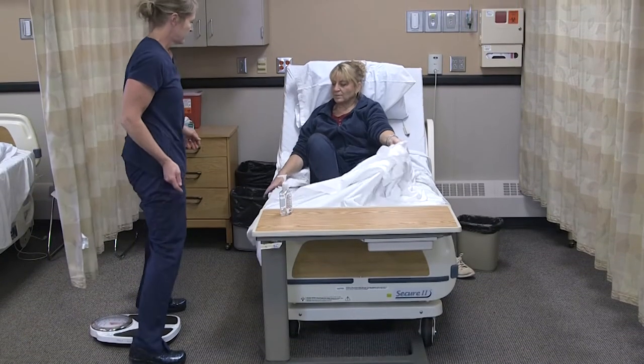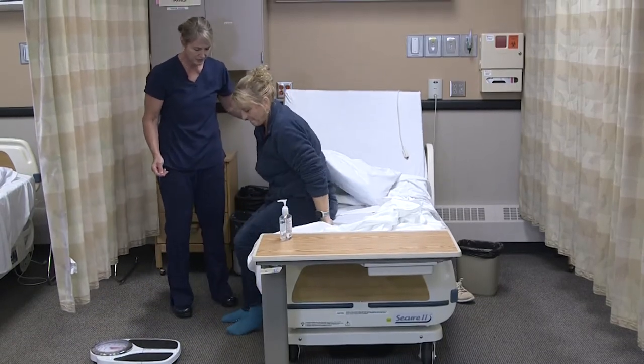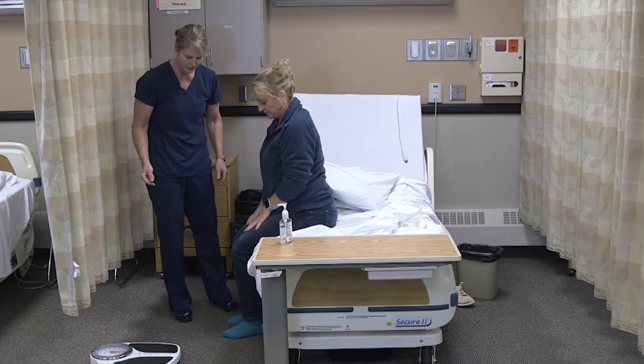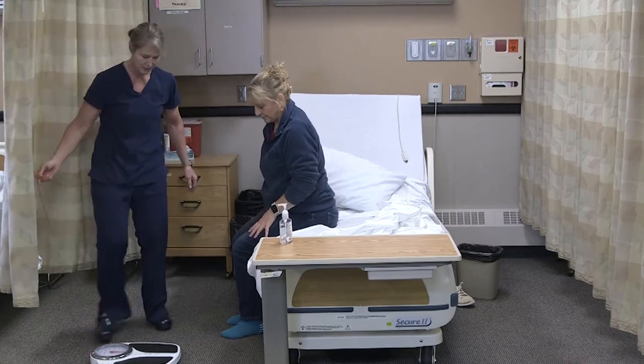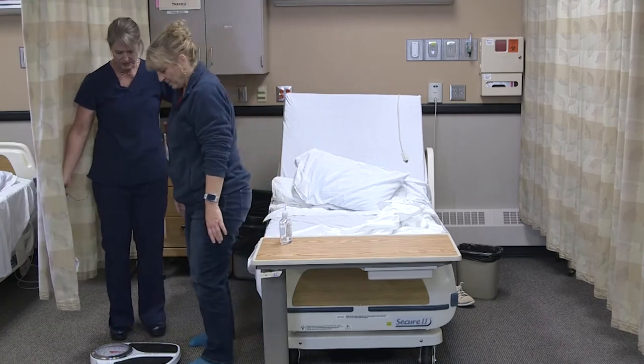Let's have you swing out of bed. I made sure the bed was lowered, and then I'm going to let her dangle. Are you feeling okay? You're not dizzy? So you have your grippy socks on. I'll have you stand up, and then take a little step up to the scale.